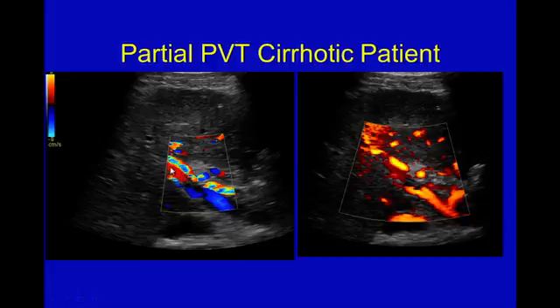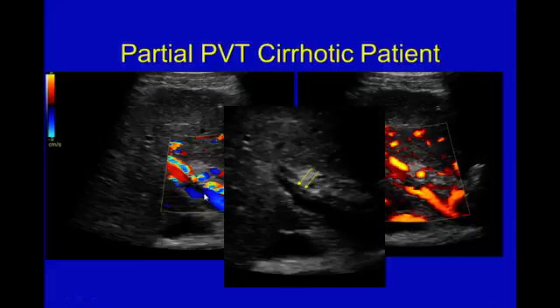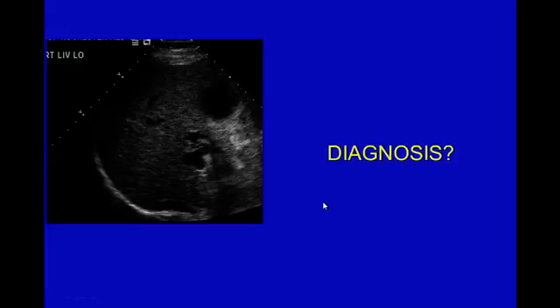Notice that the flow is going in a bidirectional waveform here. You've got flow going into the liver as well as flow that's coming out, and that's not atypical as patients' slow flow develops. One thing to notice here is that there's an area of disturbance here where the flow column is incomplete. You can see it here on power Doppler as well, and that's actually a partial clot. These are often seen much better with grayscale, so don't be afraid to turn off the color because sometimes the color will bleed over these clots and disguise them from you.